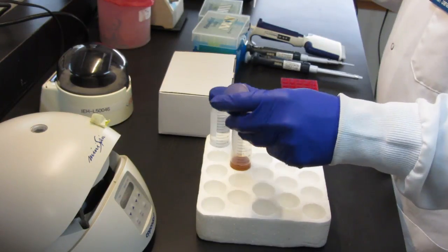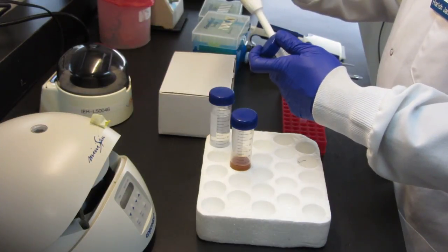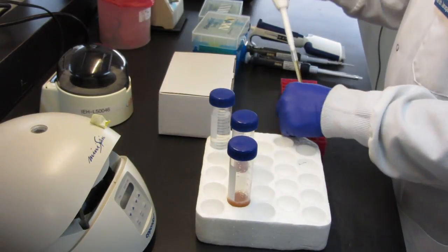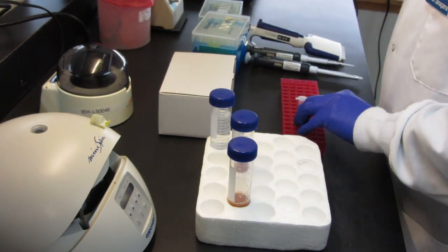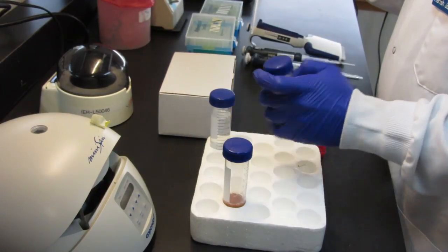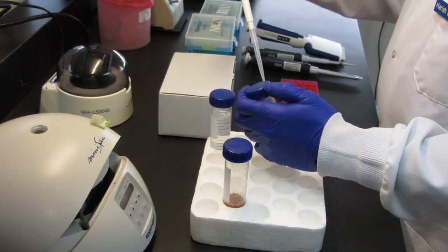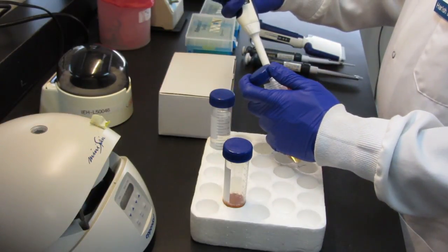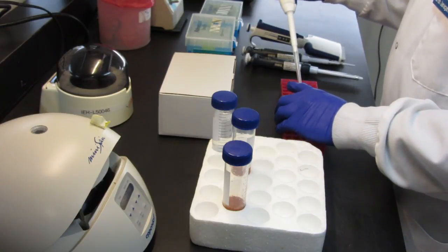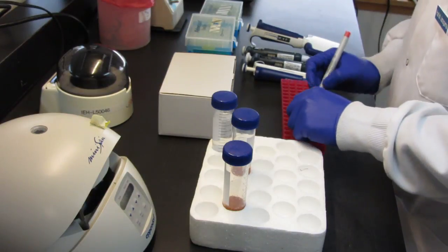To begin, briefly vortex or swirl the contents of your sample. Then take 1 milliliter of the sample and dispense it into a 1.5 or 2 milliliter polypropylene tube. Be sure to label the tubes appropriately.